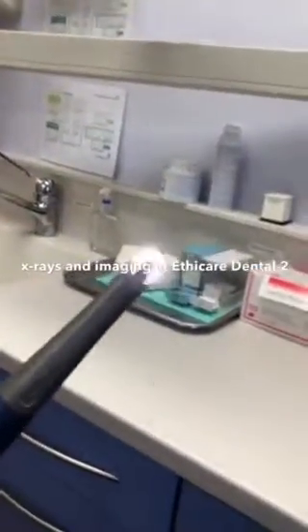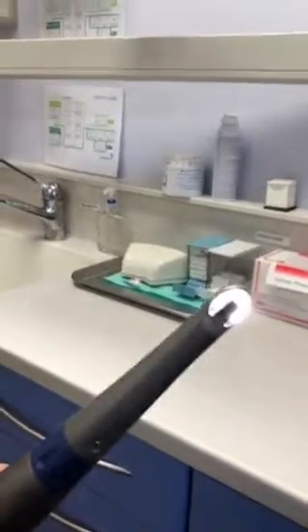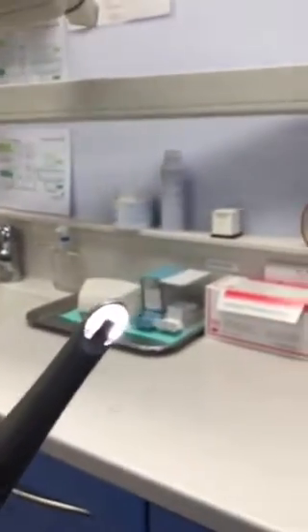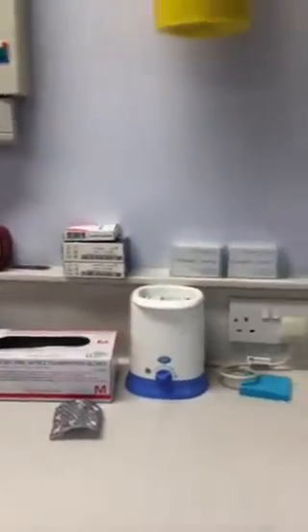On imaging and taking x-rays, what I'm holding in my hand here is what's called an intraoral camera, and this will be put inside the patient's mouth so that we can view various things inside their mouth, soft tissues and the teeth themselves. And we'll just take a closer look here.